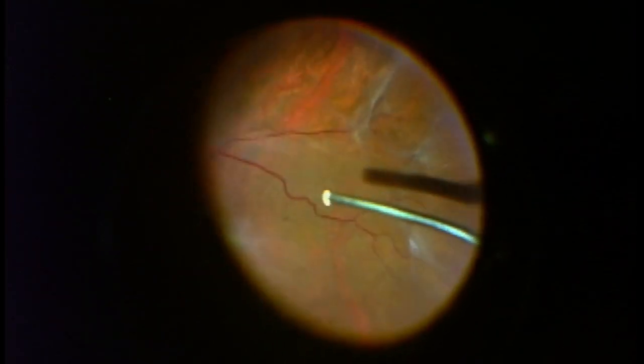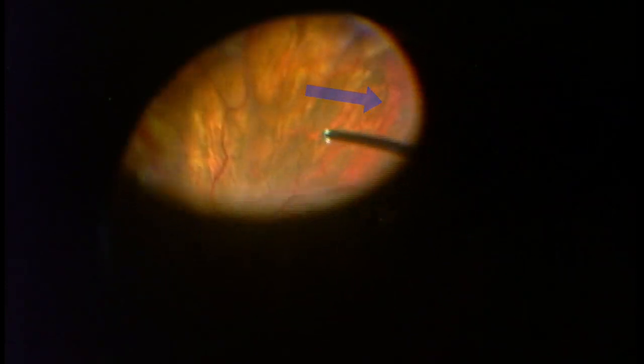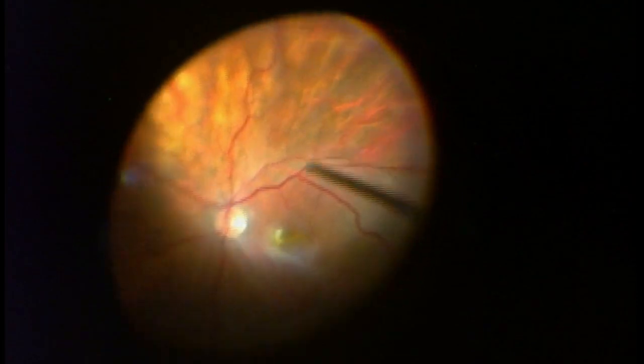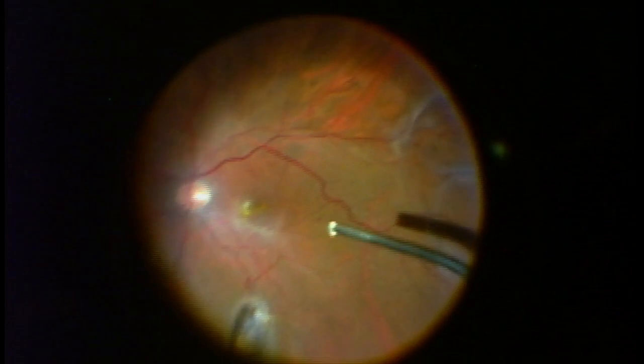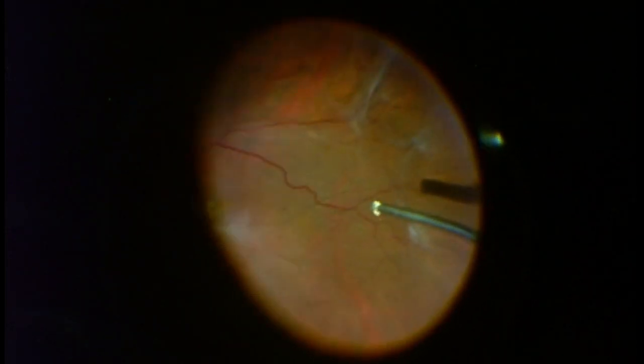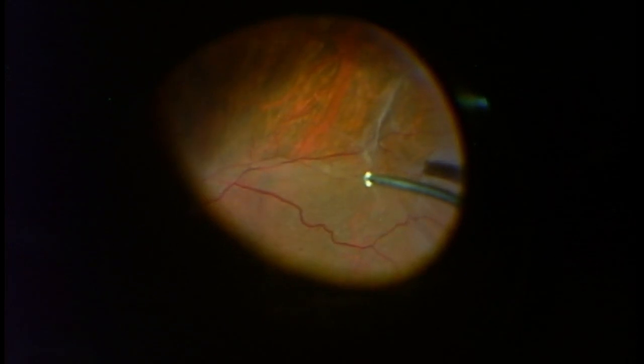If you look around the retina as I am right now, you can see some scar tissue on the surface of the retina, but the retina is completely attached. That dense black spot is actually a scar from the original surgery. In this surgery, what I would like to do is remove the epiretinal tissue near the macula.